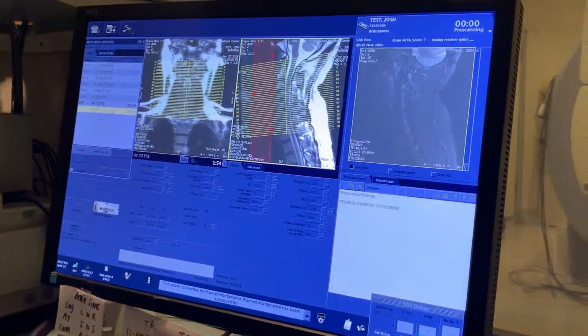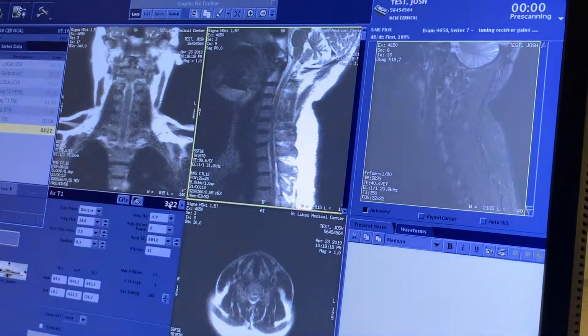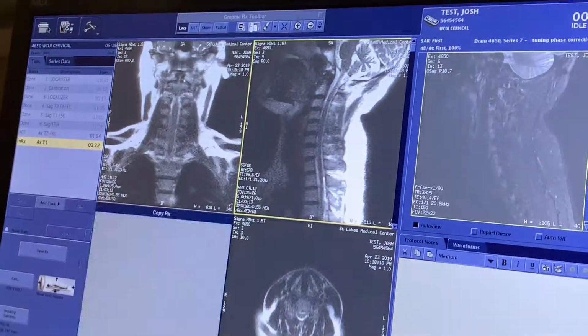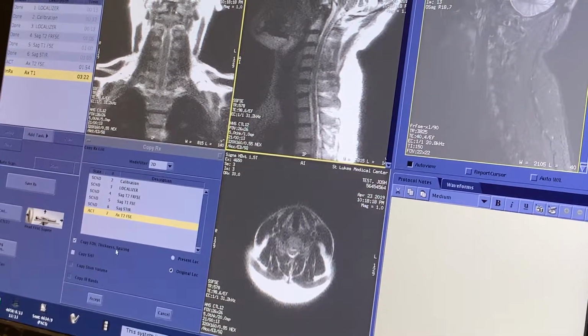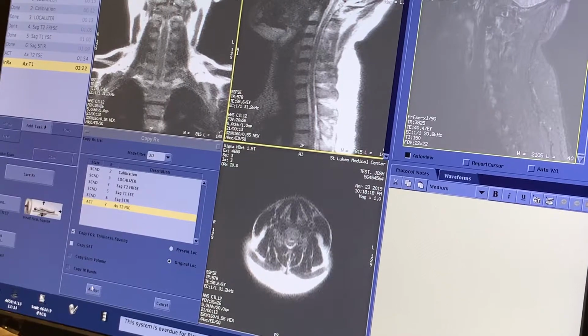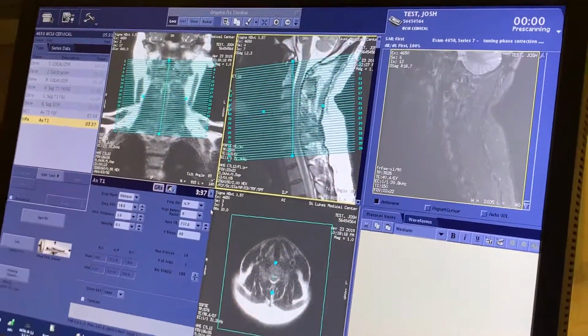Lower the sound. And then I select my axial T1. I hit setup. I'm going to want to copy the axial that I just did because it was so awesome. So I select that. And then you can leave this on because the thickness, spacing, and field of view should be the same. Hit accept, and it throws up those slices just the way they were before.